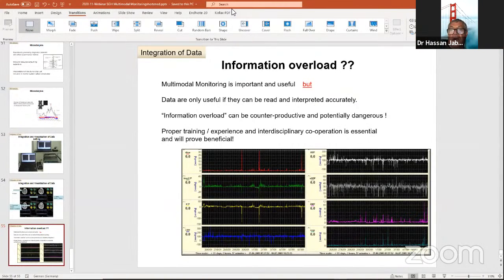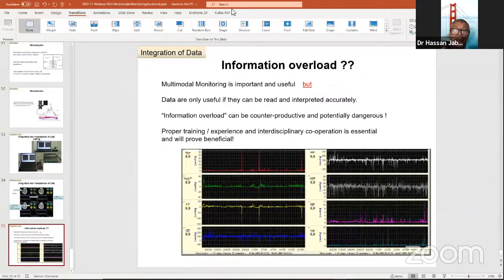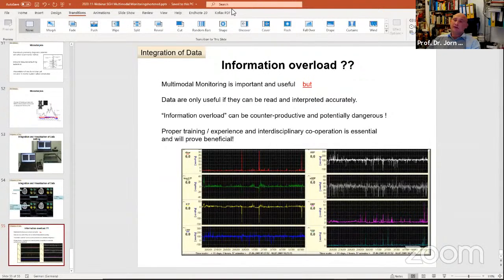You know what I feel. You know that the PO2 is a very good prognostic and follow-up tool. But correlated more to the clinical, is the ICP more accurate? Of course, because the PO2 could have many variables, and you don't build any clinical decision upon it. If the patient has vasospasm, there's nothing you can do. No, the patient has vasospasm.